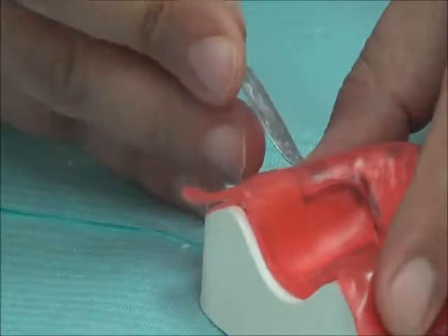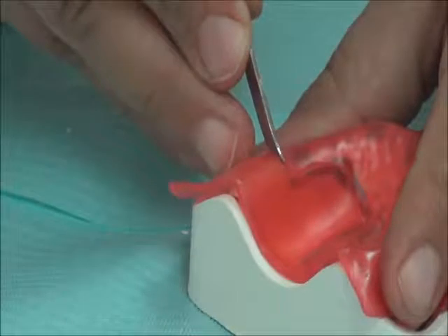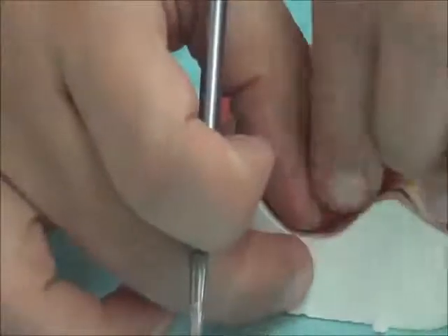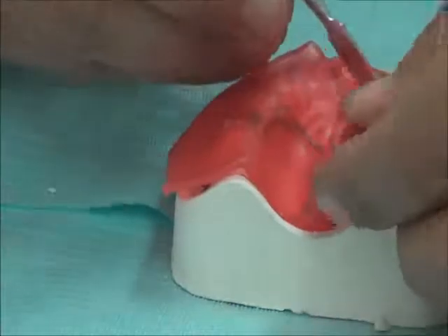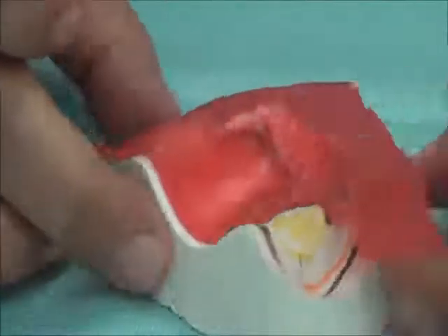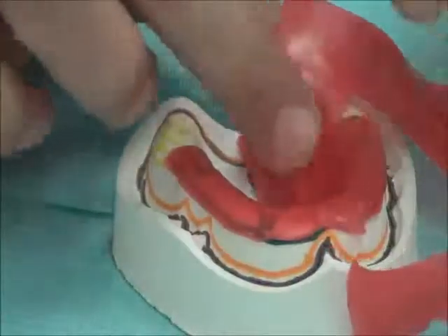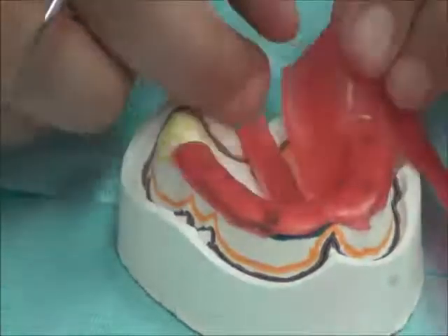I go in till the end, stop at the tuberosity area, and I'm going to remove the rest and separate the rest. You notice that the wax is still warm, so after I remove the excess, I could still adapt the material even better to the borders that I have placed.